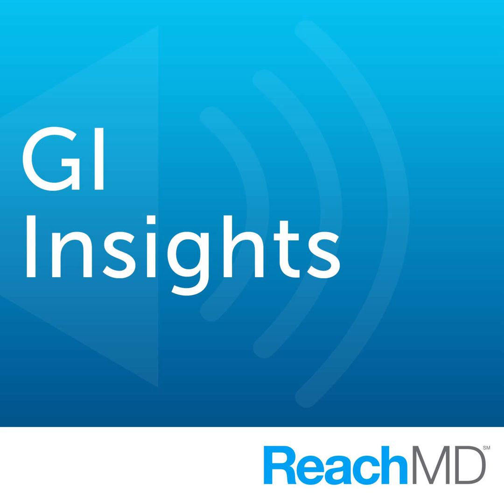Those are the main modalities, as Dr. Leighton mentioned, controlling bleeding with the same tools that gastroenterologists are familiar with in treating other forms of bleeding. You can also balloon dilate strictures. At times there are cases when, as I did want to mention, a capsule can be retained, particularly in patients with Crohn's disease, because they do develop strictures that are not apparent on radiologic imaging.